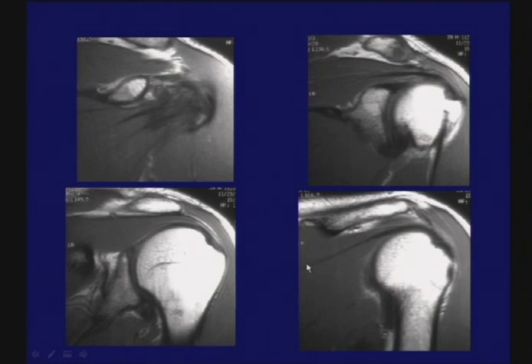There are, in fact, 3 of them, but this is the main one. Here is the tendon. It is sloped up. It's extending over the humeral head, and it, too, attaches to that middle or oblique facet. And then you can see one further landmark here. This is the posterior, sometimes called inferior or vertical facet, to which attaches the teres minor.